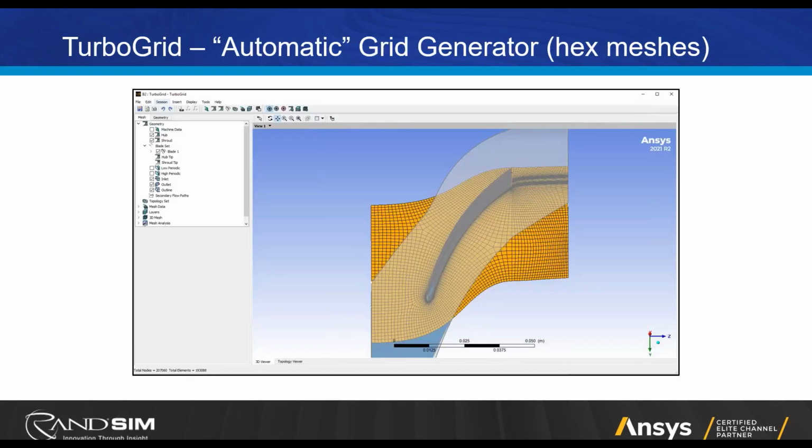Next slide, please. Okay, so this is another really powerful tool. Turbo designers, they tend to prefer hexahedral meshes. As you can see here, they're rectangular and not TETs, which is kind of the way things are going today, is TET meshes because they're easier. You can put a good mesh on very complex geometry, whereas in the old days, before TET meshes, you had to only use hex meshes, and building a fancy topology in order to put a hex mesh on complex geometry is very difficult. Well, this tool does all that for you.